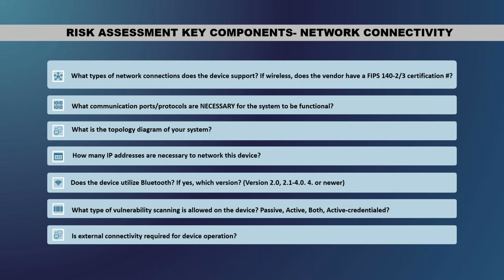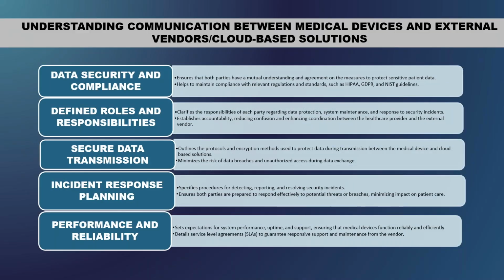You need to verify: is it a cloud-based solution? Are they accessing through a firewall? Those are the things, and we'll talk about them a little more later. Okay, next slide. This is talking about vendor access.